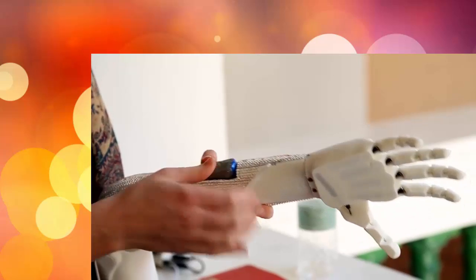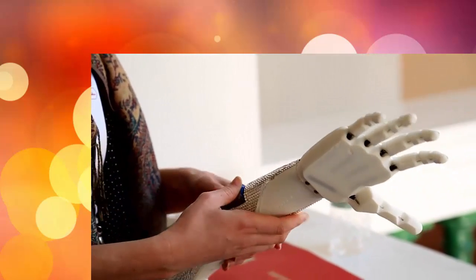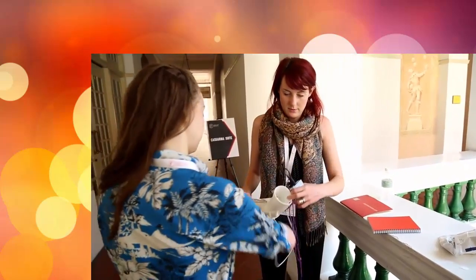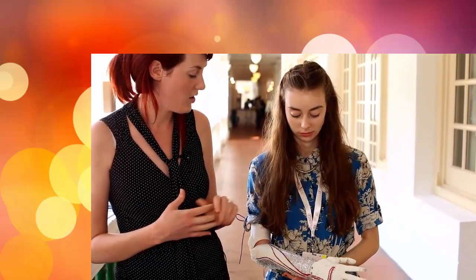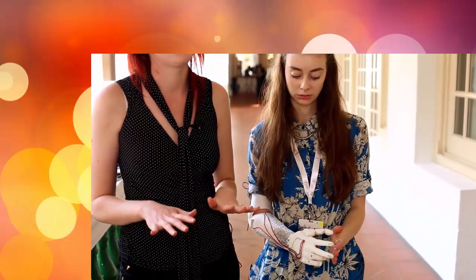So what we did, we met with Grace and 3D scanned her residual limb — her foreshortened forearm. We 3D scanned her limb, which makes a 3D mesh. Then we do a little bit of tidying up on that, make a 3D model, and 3D print it. We 3D printed this whole socket to fit Grace in just two days on the 3D printer. Then we used a photo of Grace's other hand to 3D print her a proportional-sized bionic hand.